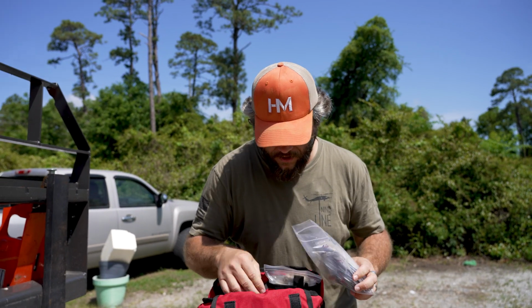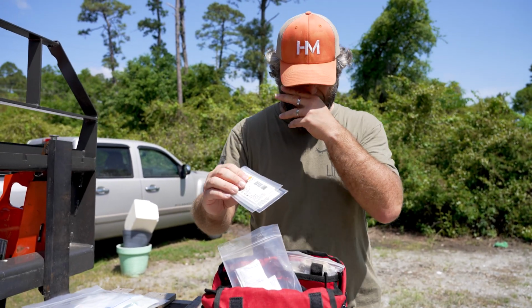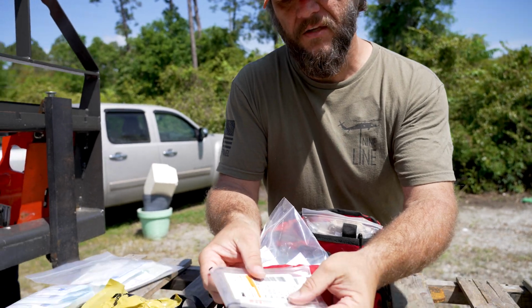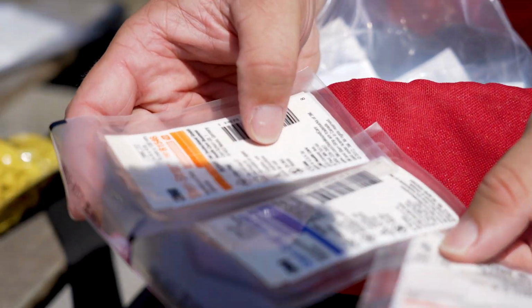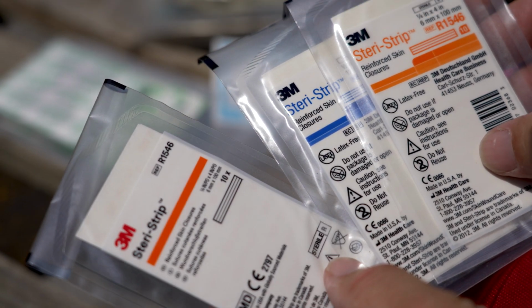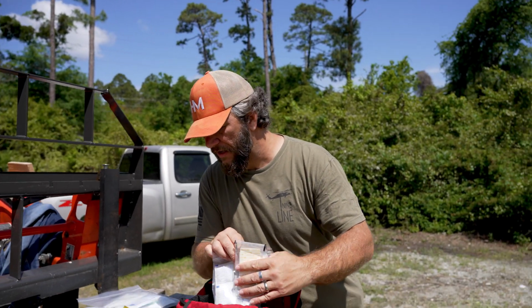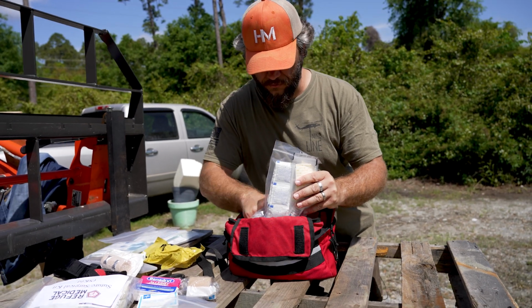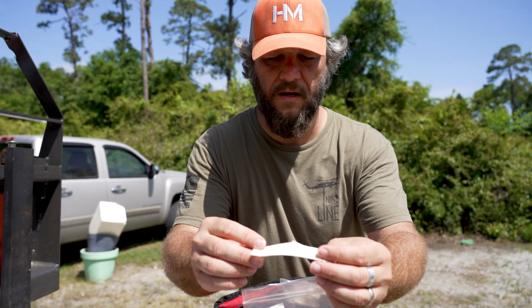Okay, and in here also, I can't remember if this came in this bag or if I put this in this bag. This is one of the coolest things in here. These are Steri-strips, reinforced skin closures. These are kind of like a butterfly bandage, but only way, way better. What you would think of. And I have already used these, and actually I kind of cut these down. I'll show you real quick.